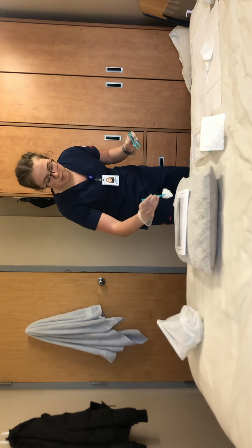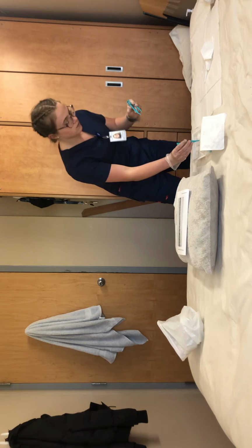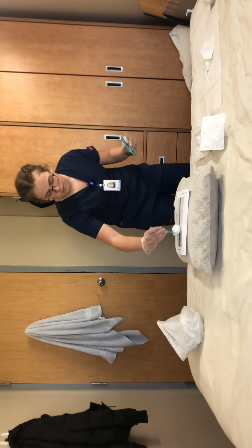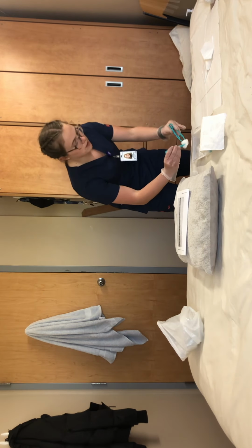So I will start within the middle of the wound because it is the cleanest. And I will dispose of that. Then I'll move on to the peri wound. One stripe down each side. And then I'll move on to the dry peri wound.